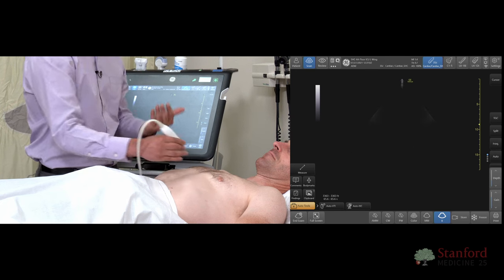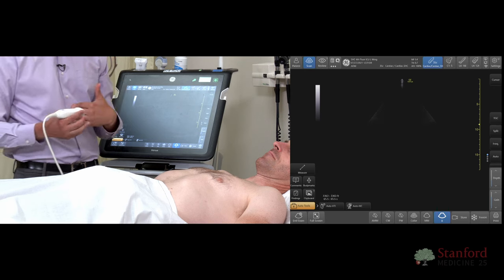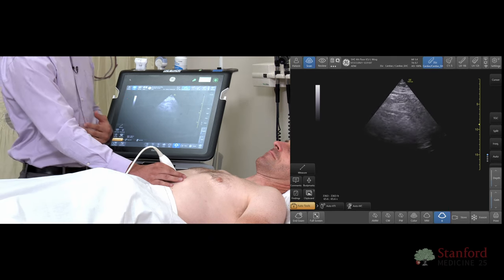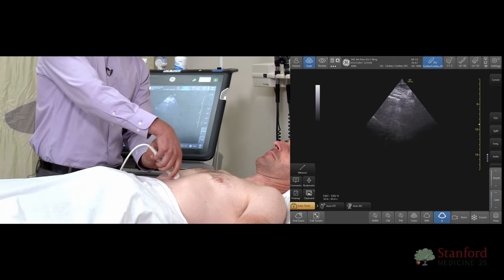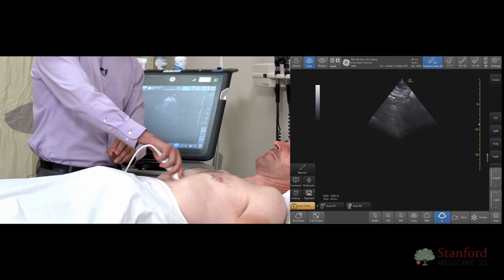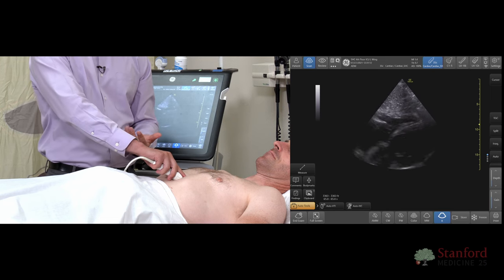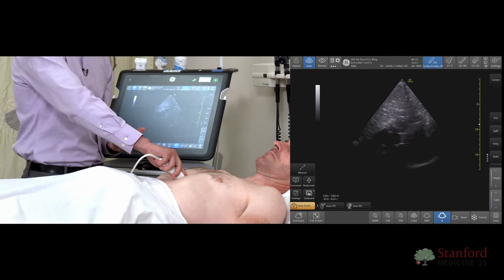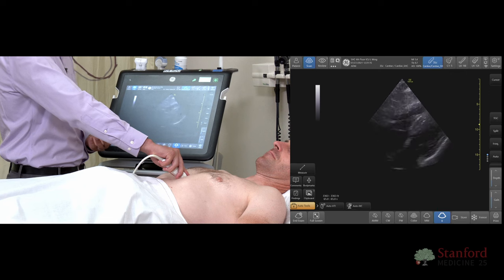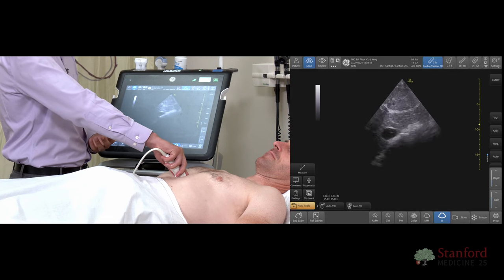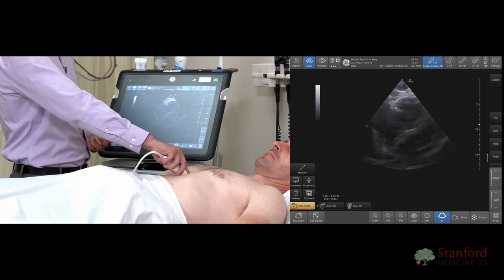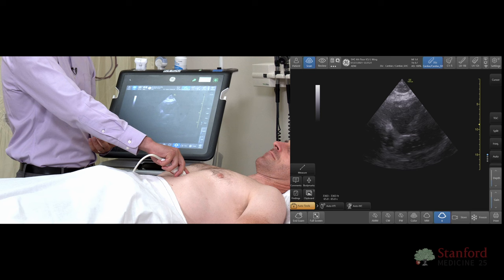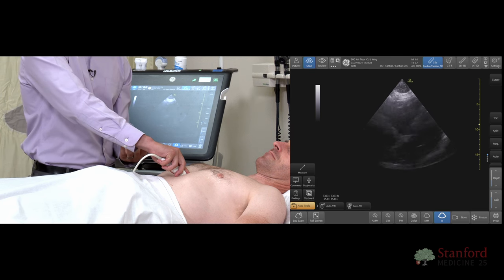When troubleshooting the subcostal view, the subcostal area might be obscured with a lot of bowel gas, and in some patients who have recently eaten, that may make it a very challenging view. To fix for this, you can have the patient take a deep breath in, which brings the heart a little bit closer to the abdominal cavity and easier to visualize.